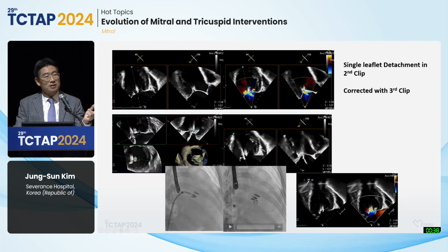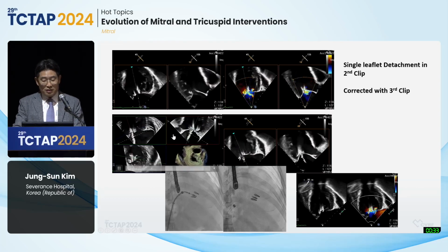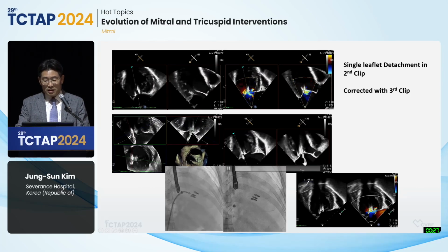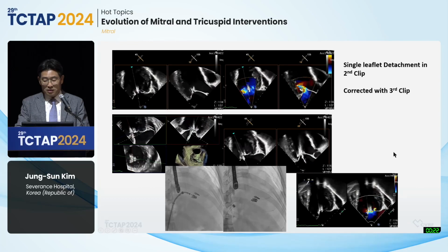Between the two clips, there is a lot of hindrance in the image. So we checked several times and separately checked the leaflet in this procedure. So finally, we captured this case.